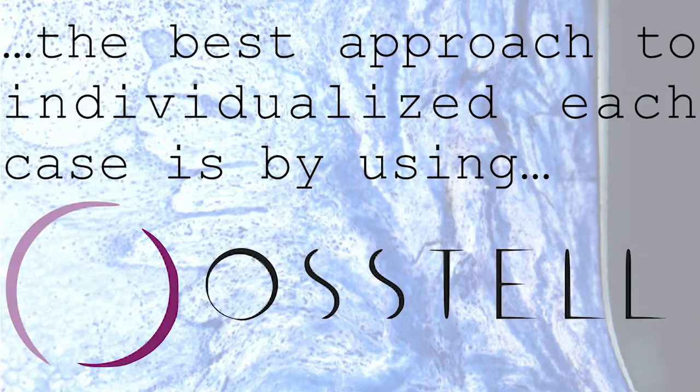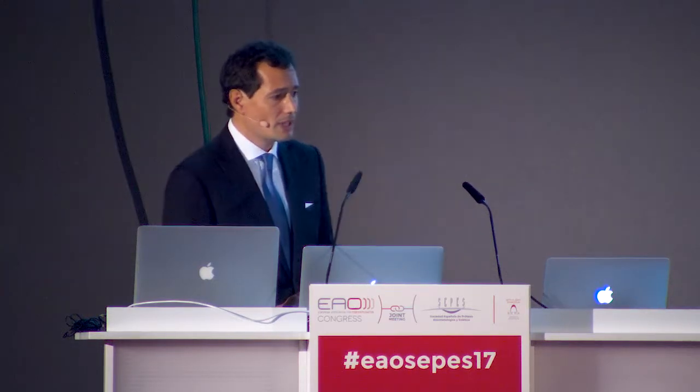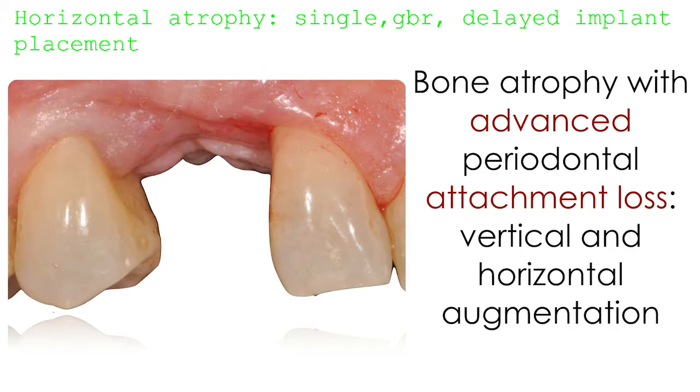So to me, the only way to individualize and customize every single healing process and to understand which is the proper time to load that implant after manipulating hard and soft tissue is by using Osstell, which is the only dynamic way to check the implant stability. So let's see together this case, for example.